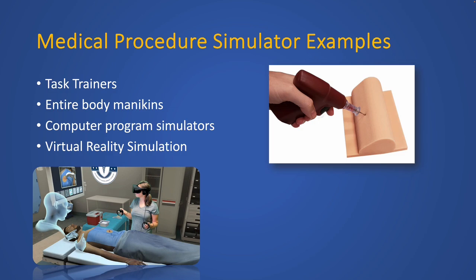The virtual reality simulator offers a procedure in a virtual setting. VR simulation may use headsets to immerse the individual in a visual and auditory enhanced environment. This will provide the individual with an added element of realism.